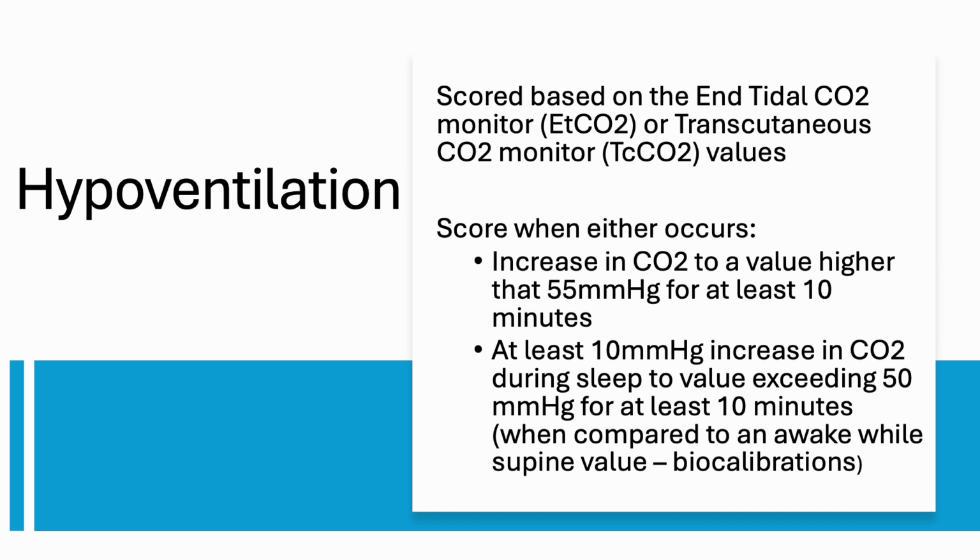Capnographs measure CO2 in units called millimeters of mercury, also seen as mmHg. Capnographs can also collect CO2 data 2 ways. The most common is with the airway and a cannula and end-tidal CO2 monitoring. It's called end-tidal because we are measuring the CO2 content of breaths at the end of an exhalation, which is the end of a tidal breath. The other is transcutaneous CO2 monitoring, and that involves a sensor that just sticks on the skin. It is a heated element, so it has to be moved every couple of hours, or it may burn the patient's skin. These are TcCO2 for transcutaneous and EtCO2 for end-tidal.